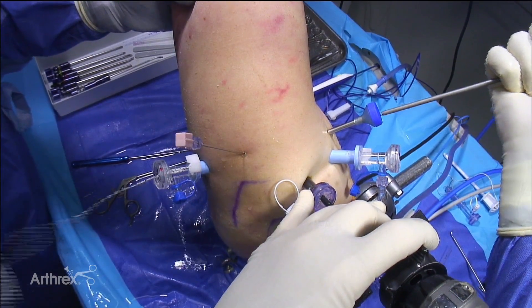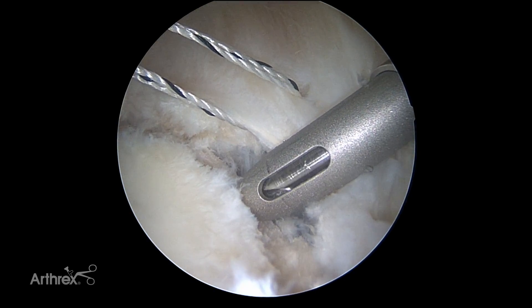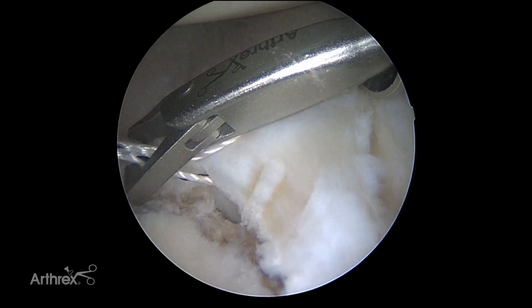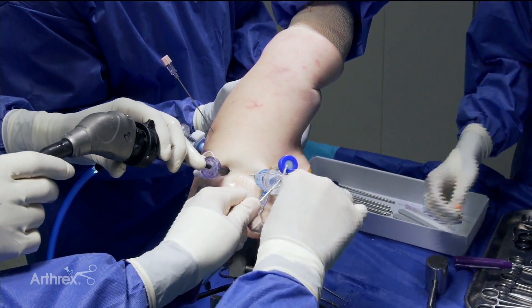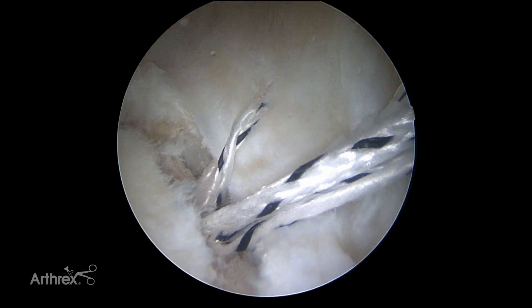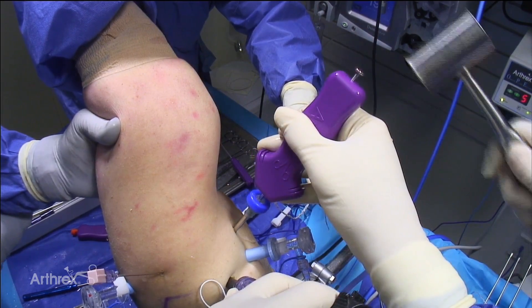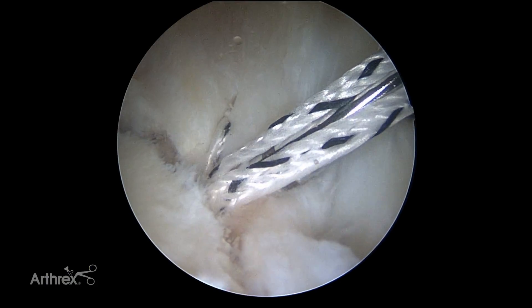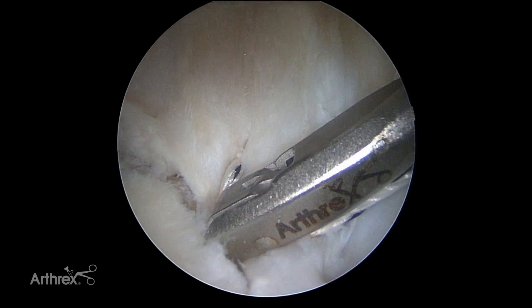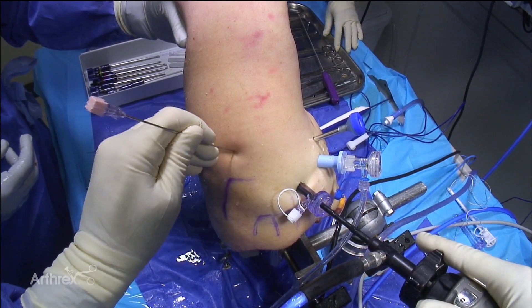We get our tape limbs out and then drill for our push lock — put our spear guide through that metal cannula and drill right there. We have a small tape retriever that fits through the small metal cannula to withdraw the tape. Now we thread our push lock using the little orange passing tab to help get it through, keeping a little slack before impacting it. Hit it down until the first thread hits bone, remove the orange tab, then impact it the rest of the way to the line — about seven or eight turns counterclockwise. There's a small tape cutter that fits down into that drilled hole.